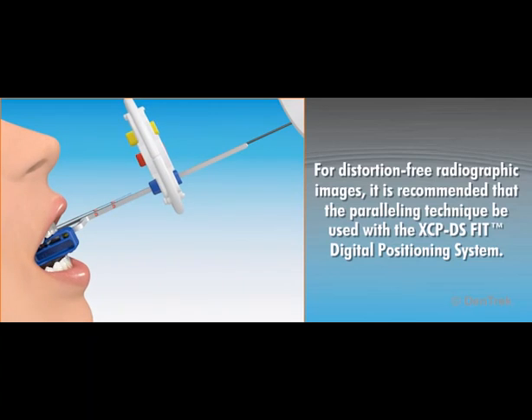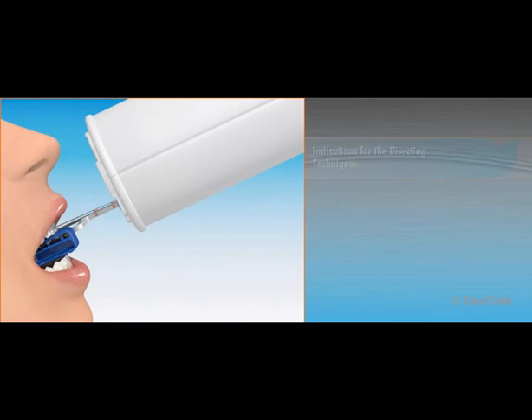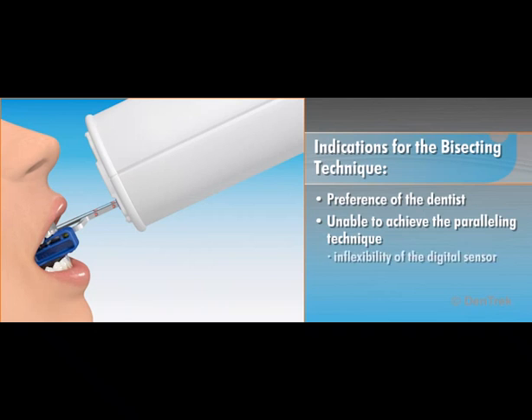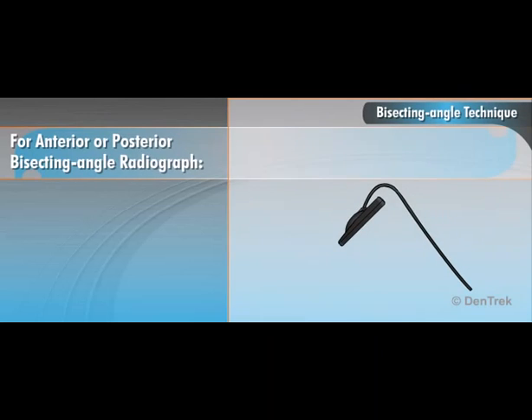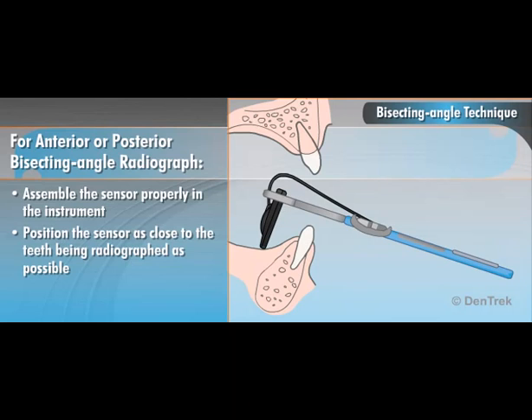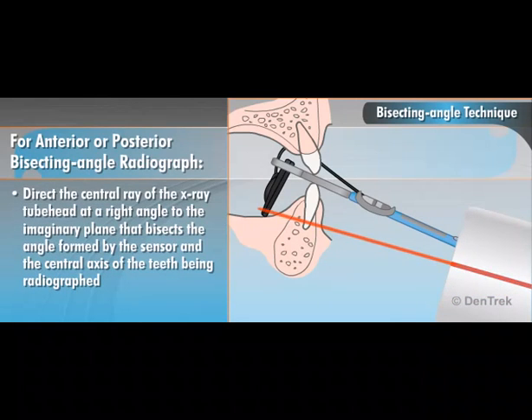For distortion-free radiographic images, it is recommended that the paralleling technique be used with the XCP-DS-FIT digital positioning system. However, if you prefer the bisecting technique or are unable to achieve the paralleling technique due to the inflexibility of the digital sensor or anatomy of the patient, Dentsply RIN offers the SnapArray DS and EasyGrip digital sensor holders specifically designed for the bisecting angle technique. For either an anterior or posterior bisecting angle radiograph, assemble the sensor properly in the instrument and position it in the mouth with the sensor placed as close to the teeth being radiographed as possible. Then, with the patient biting gently, direct the central ray of the X-ray tube head at a right angle to the imaginary plane that bisects the angle formed by the sensor and the central axis of the teeth being radiographed.